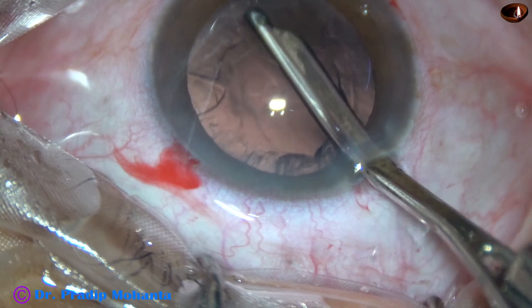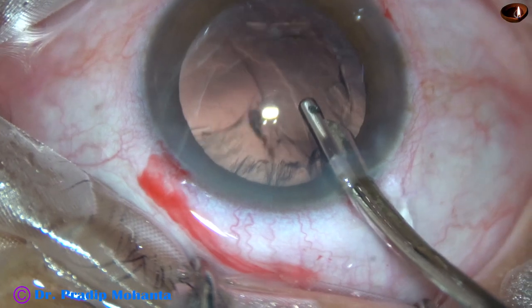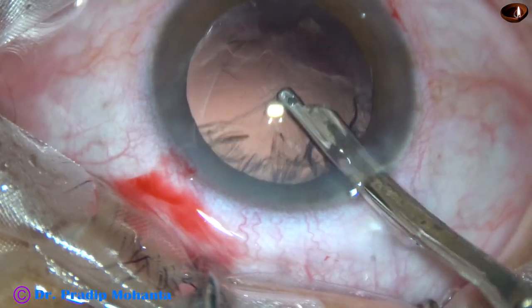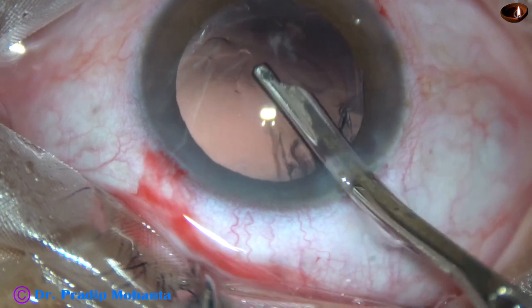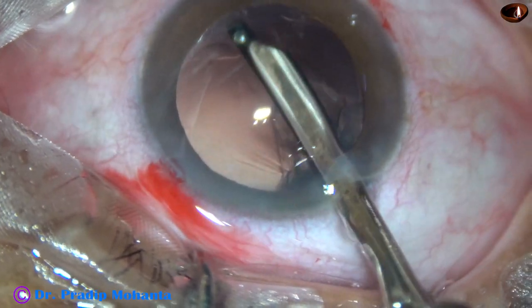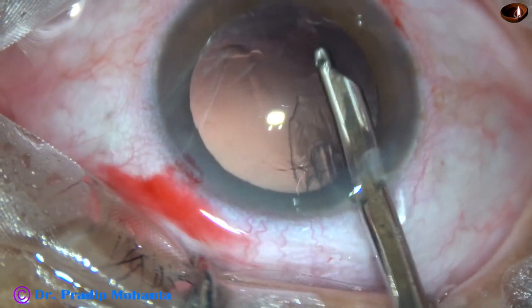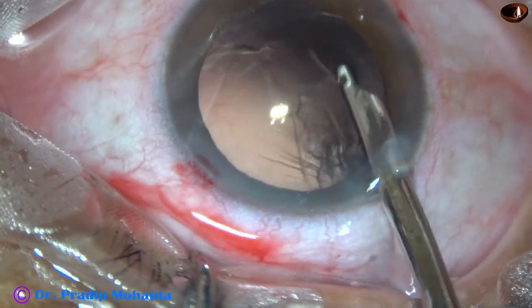Now, cortical cleanup is being done with the help of the Simcoe cannula. By this time, the assistant is getting ready with the intraocular lens. The cortex from all around has been removed. The sub-incisional cortex is to be removed. Some fibers are sticking to the posterior capsule, and that is removed from 6 o'clock.